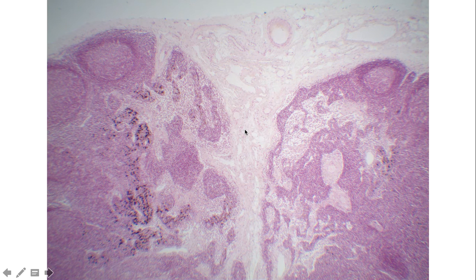This is the area of the lymph node where this large efferent or exiting vessel is going to leave. You'll also notice here, this outer area is going to be the capsule, that dense irregular, collagen-rich layer. There are areas where it does extend down, right? And so there are some of these areas that we're going to refer to as trabeculae. And these trabeculae are areas where the cortex dips down a little bit and often is going to then separate a couple follicles.